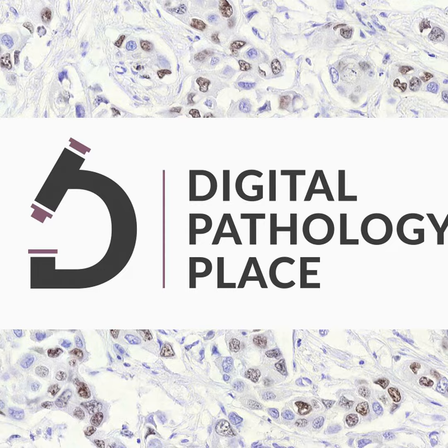It has a certain appearance, and then you really just need to go down to 20 or 40 or even sometimes oil to verify something that is a lower power impression. And consider that a lot of the scanners in this class can do 20 and 40x, but by definition, without compression, the 40x images are 4 times bigger, and they probably take 4 times longer to collect, roughly. So the question is, do you need that for primary diagnosis?